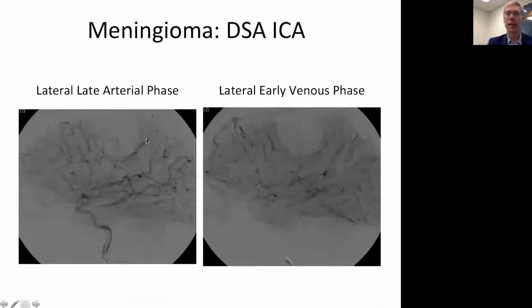And this is kind of the classical picture you get with a meningioma, and this is why angiography has been around so long. It predates CT and all these other cross-sectional images. And so this is how they used to diagnose tumors, obviously, by looking at how the brain was splayed and where it was splayed relative to these tumors, to make a determination as to what they were dealing with before they went into the OR.